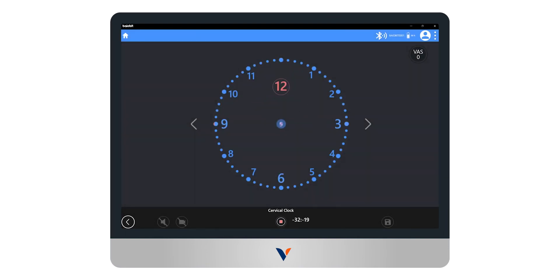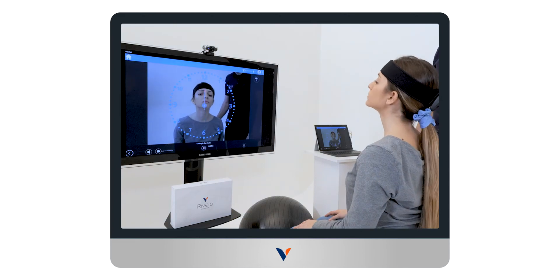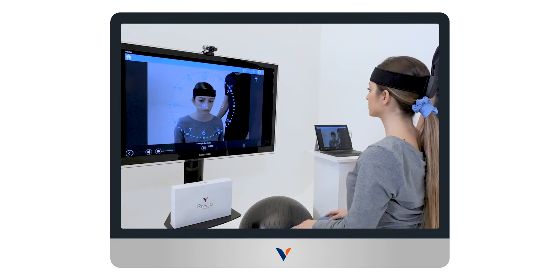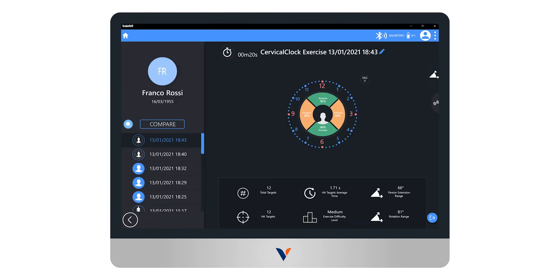The patient then carries out the exercise, guiding the red dot displayed on the screen by moving his head, hitting the highlighted targets as precisely as possible. The test ends and the results are automatically saved when the trial duration or number of repetitions are reached.